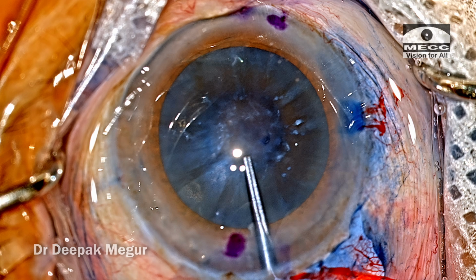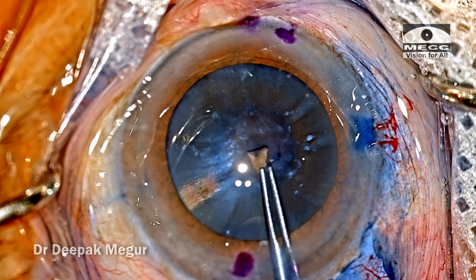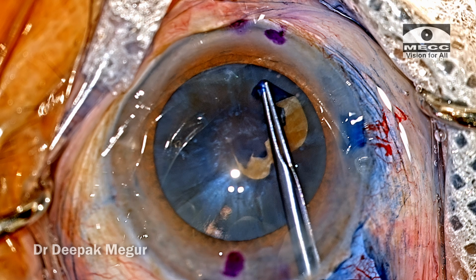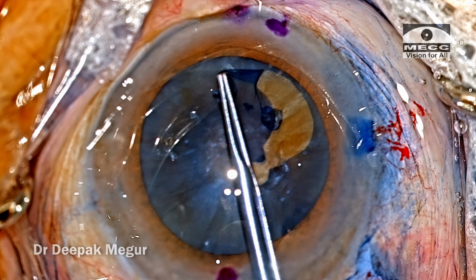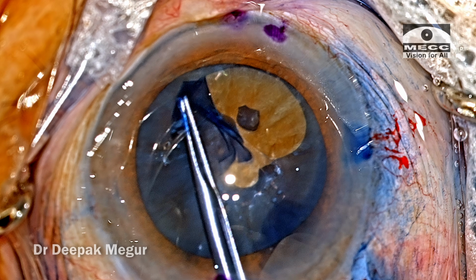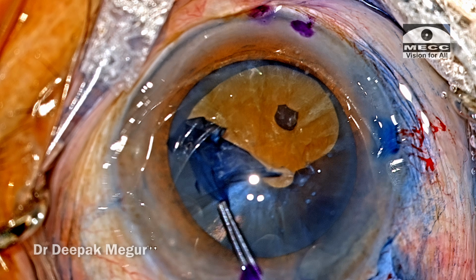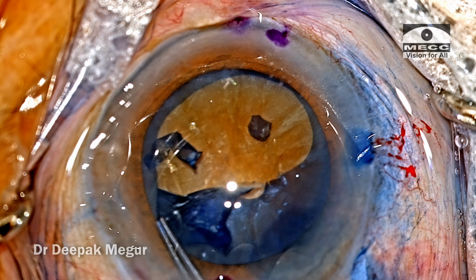So as I puncture the anterior capsule, we can see that the lens is wobbly, the flap is raised, and as I begin to tear, I also realize that the capsule is extremely fragile and thin, so it has a tendency to tear off. Nevertheless, the rhexis is begun. An important consideration here would be to have an adequately sized rhexis, simply because the underlying nucleus is quite hard, and I don't want to cause any trauma to the bag while maneuvering the nucleus.